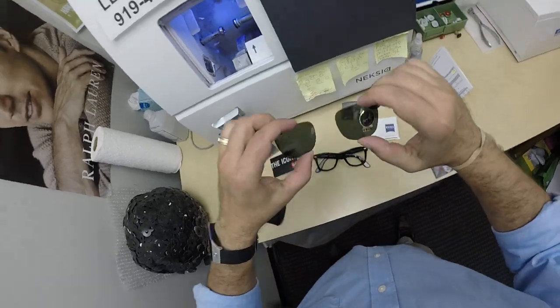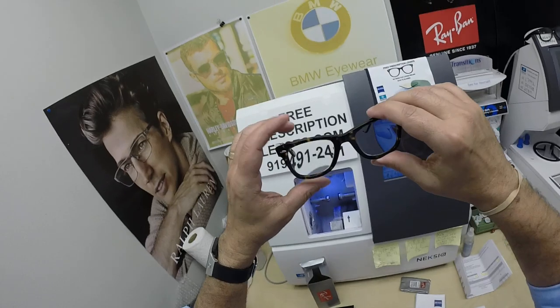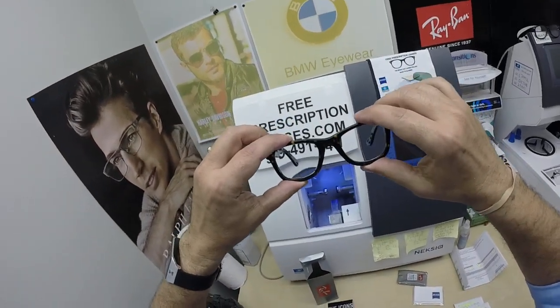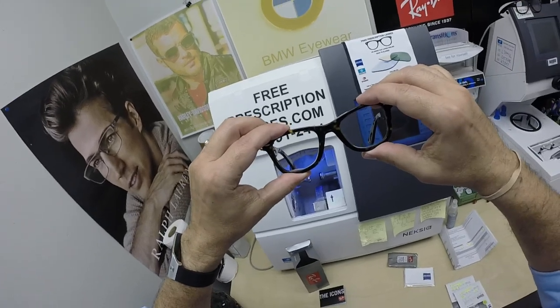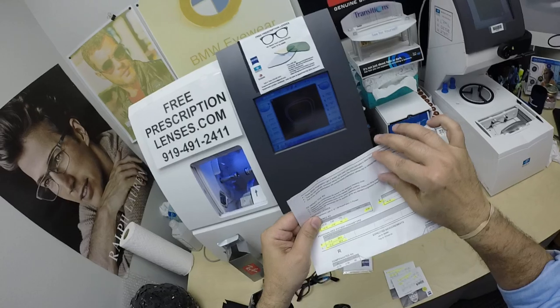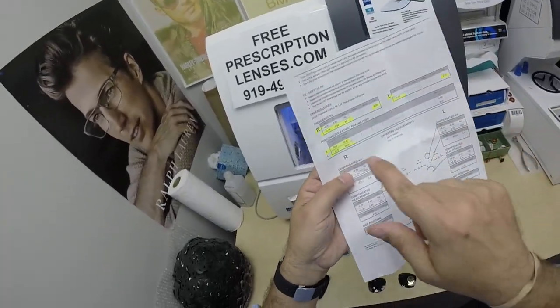It comes with the original demo lenses that I've taken out and installed his Zeiss Light D digital free-form progressive lenses with the Photofusion Green and DuraVision Platinum, the premium anti-glare coating. Of course, the top of the screen got cut off here, but he did get the Light D — I can prove that a little bit later.